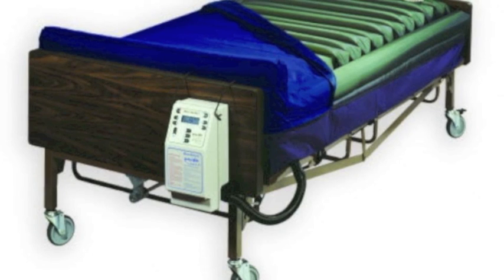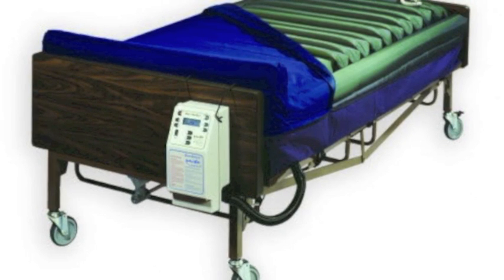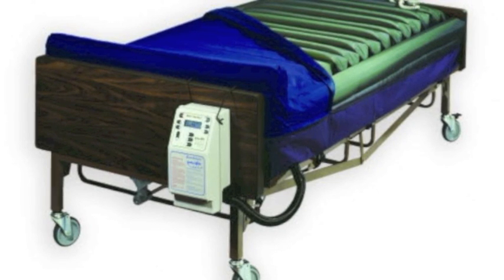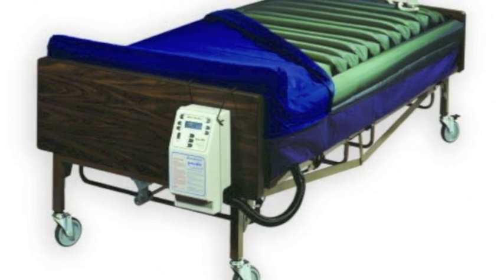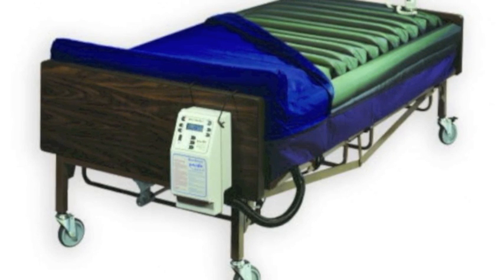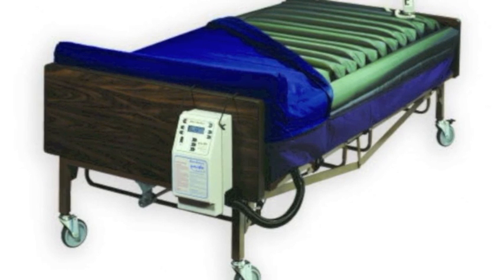We can now move on to setting up the air pump and control unit. Place the pump over the footboard using the given handle. Take the hose and attach it to the hole on the pump. Turn it until the latch clicks and the hose feels secure. Now, place the other end of the hose into the hole in the mattress at the foot of the bed.